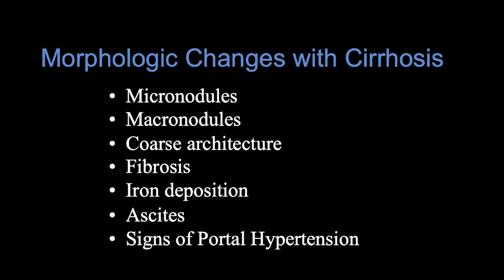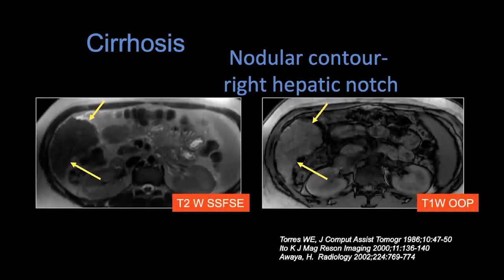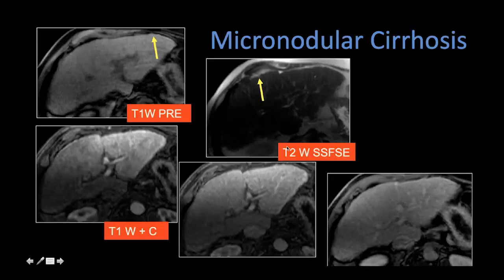The morphological changes that we see with cirrhosis can be varied. It can be micronodular or macronodular. You may see changes in architecture, the presence of fibrosis, varying iron deposition patterns, and of course ascites and other stigmata of portal hypertension. We can see nodular surface, and sometimes the other features we'll see is a right hepatic notch sign, which is often tucked in between segment five and six of the liver. You may see these small nodules around the edges of the liver — micronodular changes.